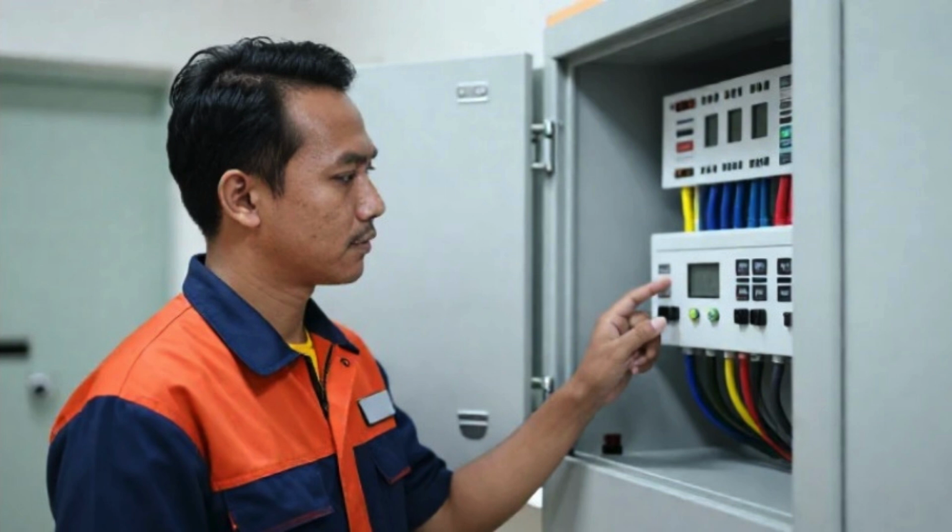to disposal. In modern hospitals, the increasing use of networked and computerized medical devices introduces additional safety considerations. While these devices improve efficiency and data management, they also depend on stable power supplies and proper electrical infrastructure. Power failures, voltage fluctuations, and electromagnetic interference can affect device performance and safety. Backup power systems, such as uninterruptible power supplies, are therefore essential.